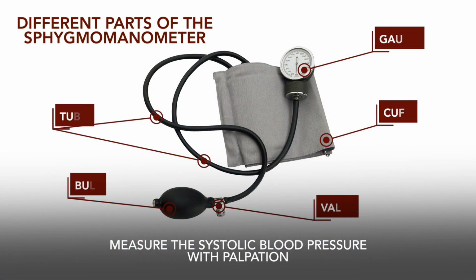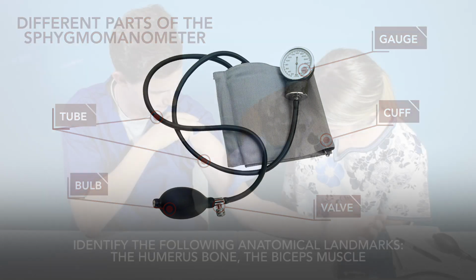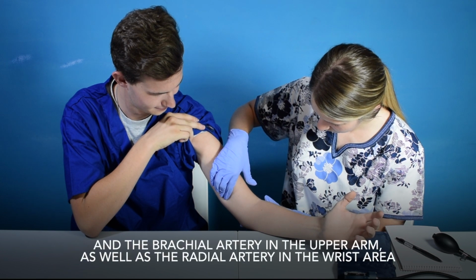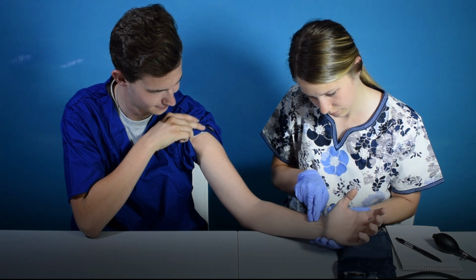Measure the systolic blood pressure with palpation. Acquaint yourself with the different parts of the sphygmomanometer. Identify the following anatomical landmarks: the humerus bone, the biceps muscle, and the brachial artery in the upper arm, as well as the radial artery in the wrist area.